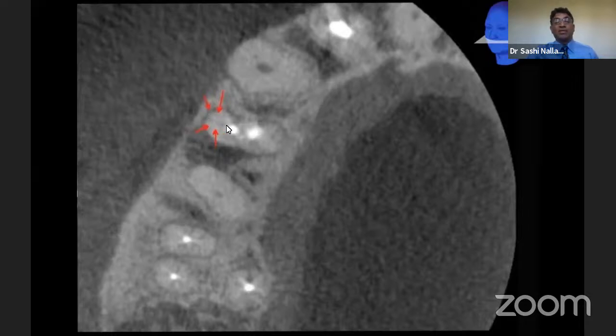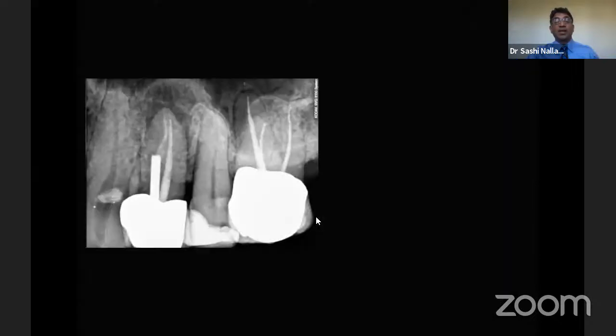It is not a crack. Please don't think that CBCT can show these sorts of things, especially when there are root canal obturating materials around causing these artifacts to open up. Okay, so it's a reconstruction artifact. It makes you believe it is a crack. But remember, the pocket is on the distal. So this is where the bone loss is. So if at all there is a crack, you may be seeing it in this direction, not necessarily there where there is good bone. So I said, okay, well, let me give it a shot.